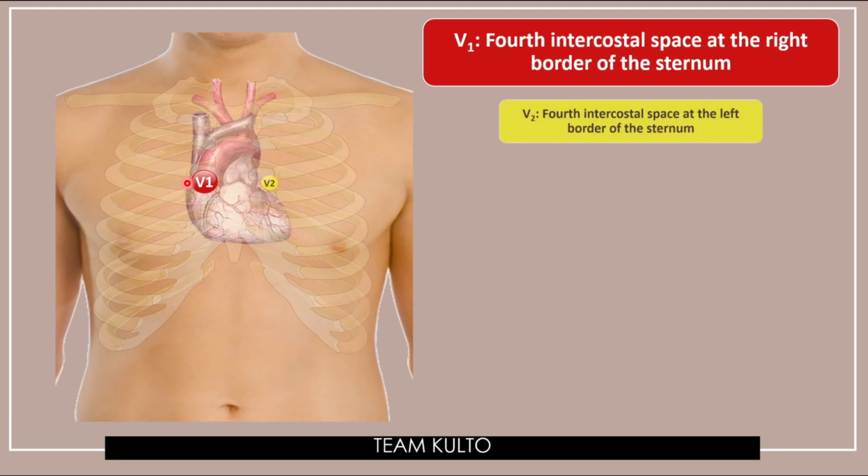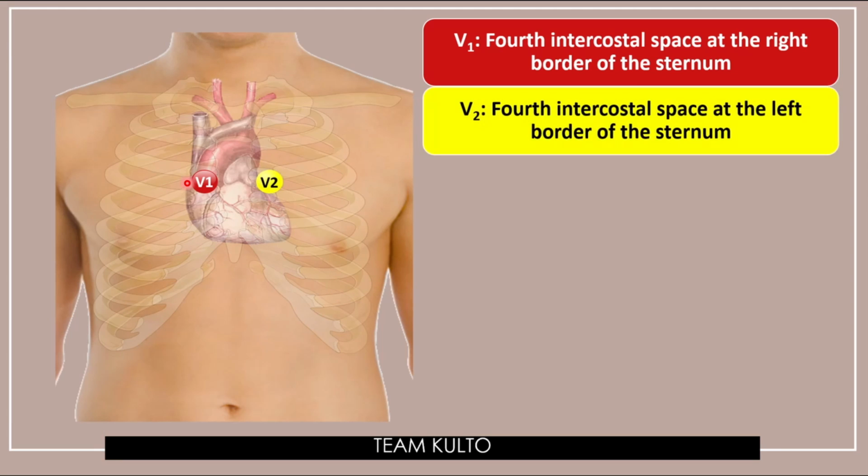Next. Yung yellow, saan siya, sa V2. Itong kulay na ito ay depende to ha. May iba-iba kasi, kagaya ng sinabi ko, manufacturer, iba-iba yung kulay nila. Pero mapapansin mo dun sa electrode, may nakalagay naman doon, may legend. May V1, V2, V3. Sundan mo lang yon. It doesn't have to be red, it doesn't have to be yellow. Nilagay ko lang tong kulay na to para talagang may visualization kayo, para hindi malito-lito.